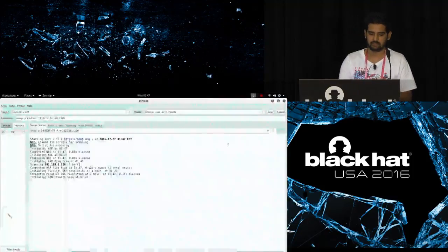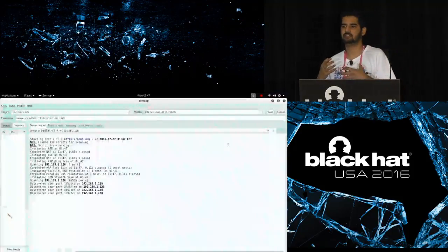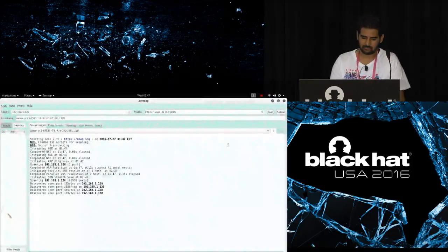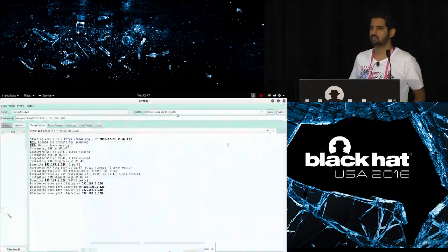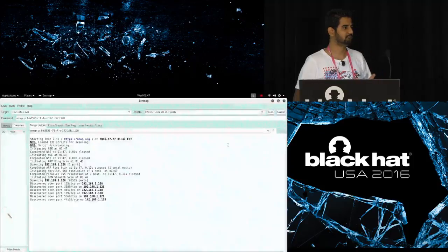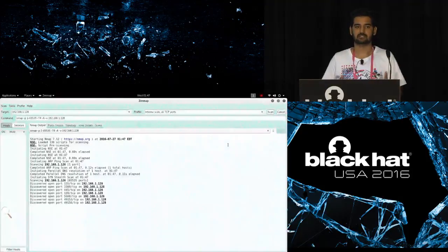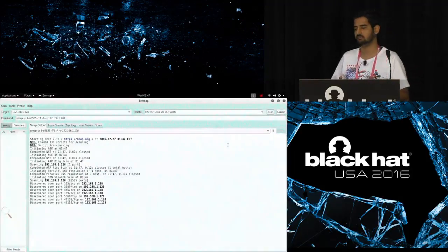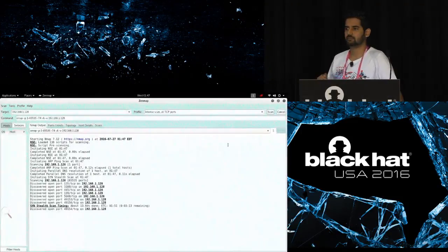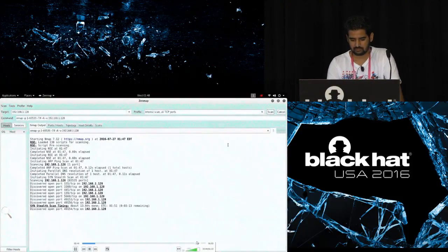So if you can see over here, this was the IP that was running HL7 messages. This is a listener on HL7. You would find this on EMR or compatibility software inside a hospital. When I start a scan, I do an intense scan, all TCP ports. Now, keep in mind, if you're doing this in a live hospital environment, do not go for an intense scan. The reason is some devices might crash. I've not seen devices crash on me, but I've seen some researchers come up and say, oh, we've crashed a medical device by just running an Nmap scan. This is an infrastructure that I control, so I can run an intensive scan. All right. So I'll just skip to the end.